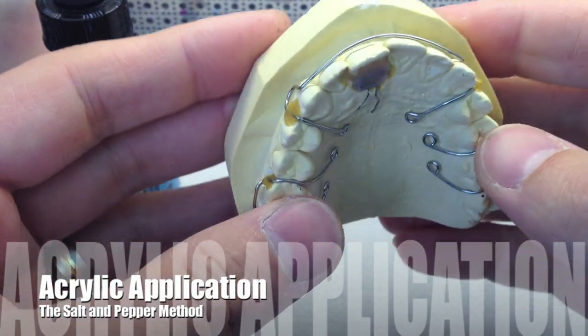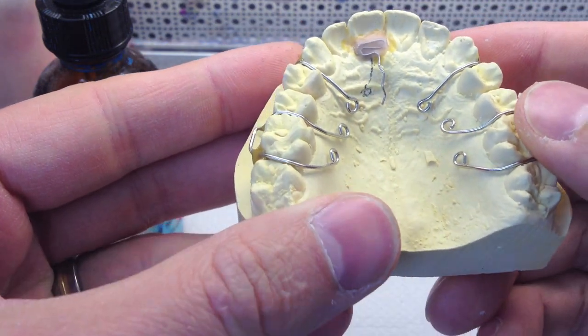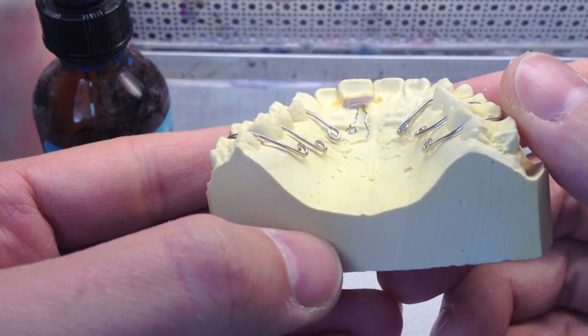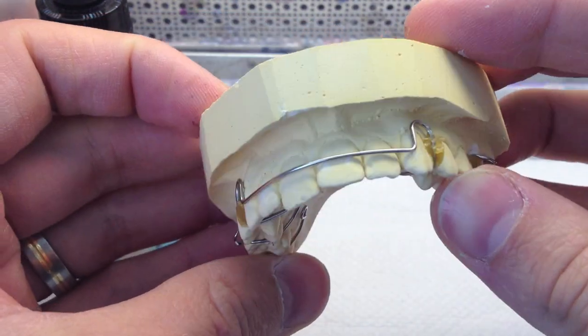Hey guys, I thought I'd put together a little video of how I do my simple little pour-ups. What I have here is a completed wire bending stage retainer.